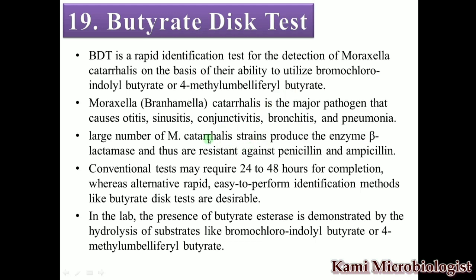Now we have a large number of M. catarrhalis strains that produce an enzyme called beta-lactamase, and due to the production of this enzyme, this bacteria becomes resistant to penicillin and ampicillin antibiotics. If we do not perform this test, the conventional test method requires 24 to 48 hours.